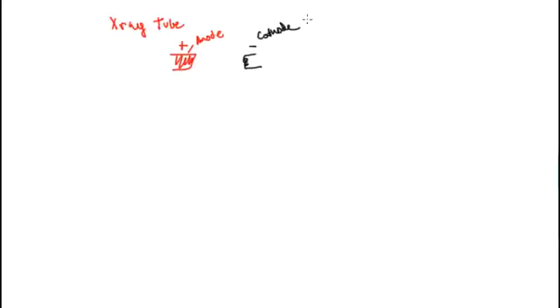It's called the cathode. So electrons are essentially boiled off the cathode and they move towards the anode because remember they have some voltage V between them. So the electron is going to go this way over to the anode. It's going to hit the anode, and that's where the action happens. So let's zoom in on this anode if we can.